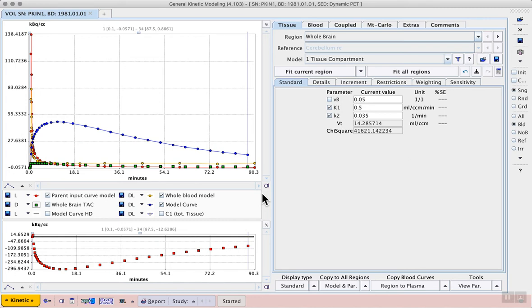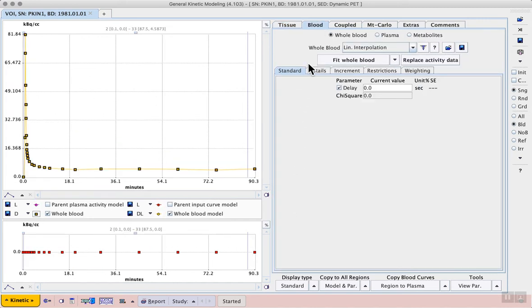Since the plasma data already accounts for metabolism of the tracer in the body we don't need to load a parent fraction. On the blood tab we can also check blood data and we can add a delay, which is an important concept in studies with external measurement of the tracer activity.